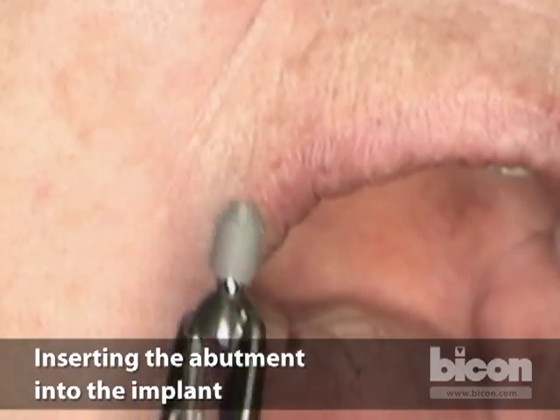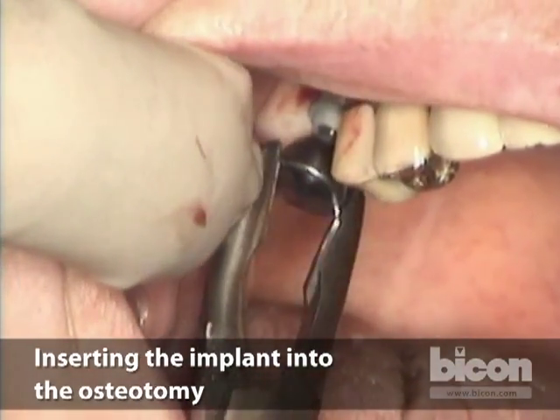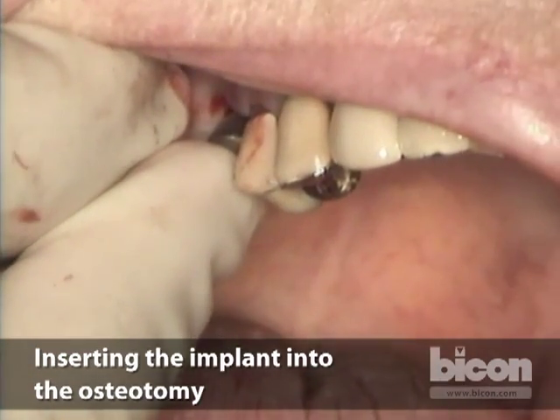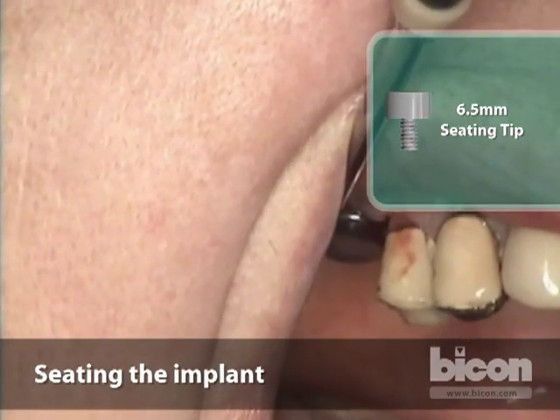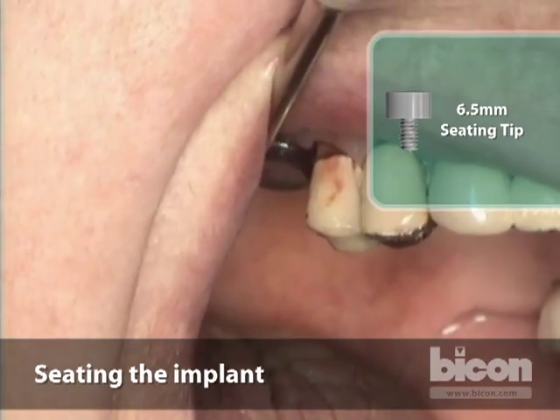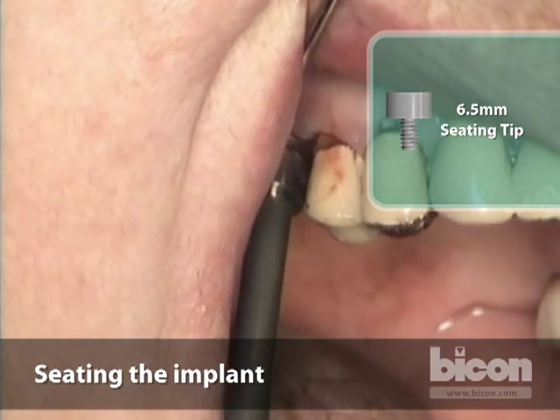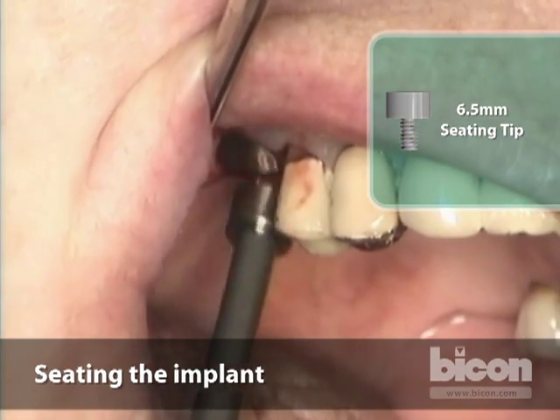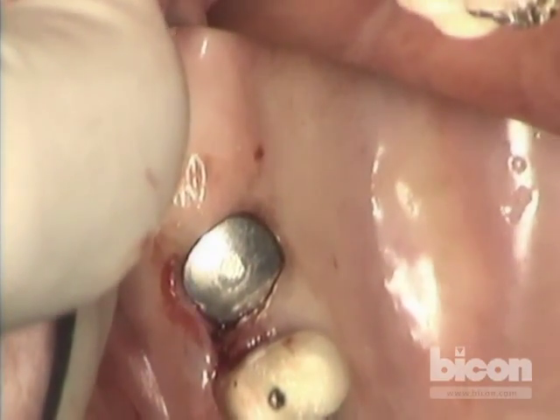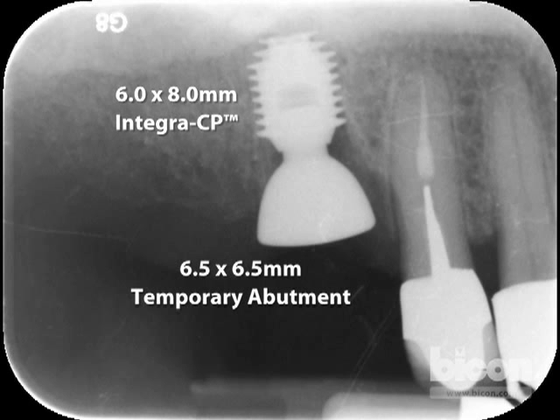Now we have a one-stage implant; you may have to use a little twisting to make sure it goes in the proper osteotomy. It's a friction-fit implant, so we push it to seat as much as possible. We use a seating tip that is as wide as the top of this abutment; that also comes in the kit. The osteotomy will guide it in, so we'll give it a couple of taps — and you can hear the difference in tone. The post-op radiograph shows a one-stage implant filling the osteotomy with primary stability and plenty of bone contact.